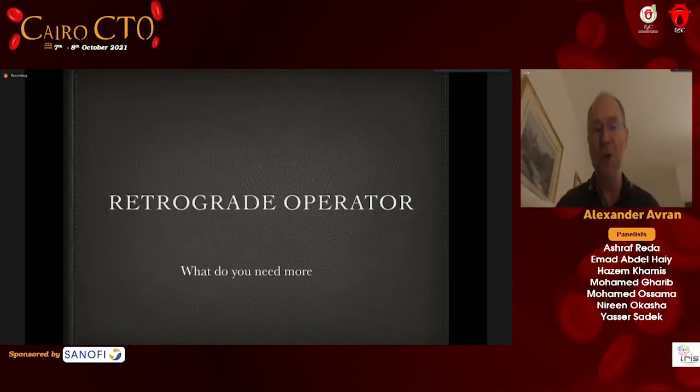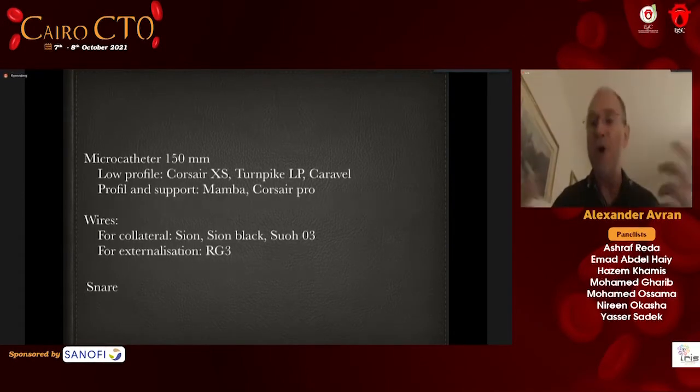If you are also a retrograde operator, what do you need more? So you need a longer microcatheter. So you need a 150 microcatheter. In that situation, you need a low profile one. So you have the name, there are others on the market.